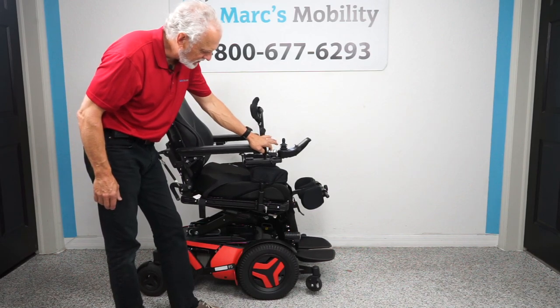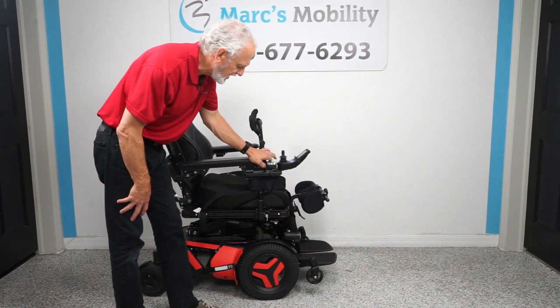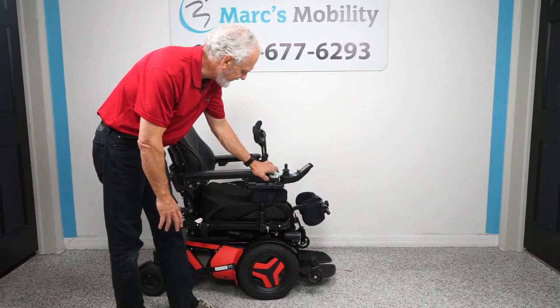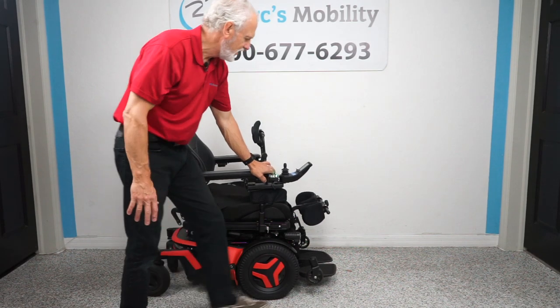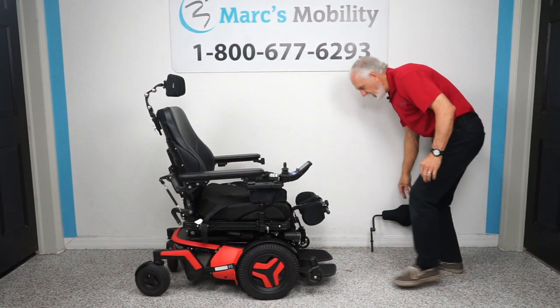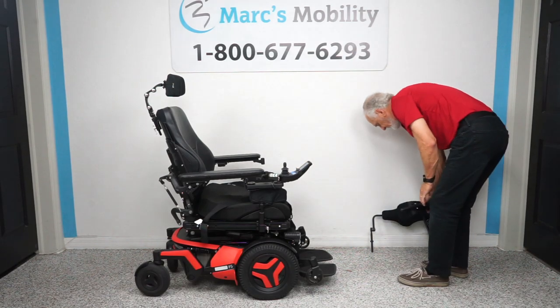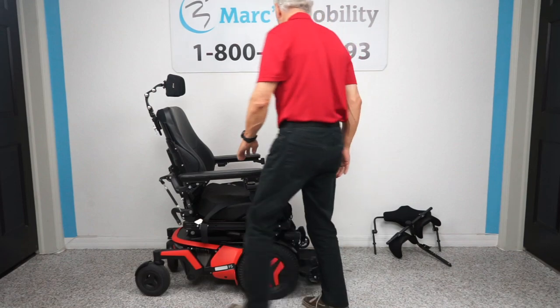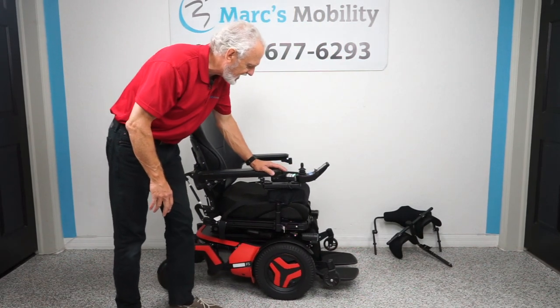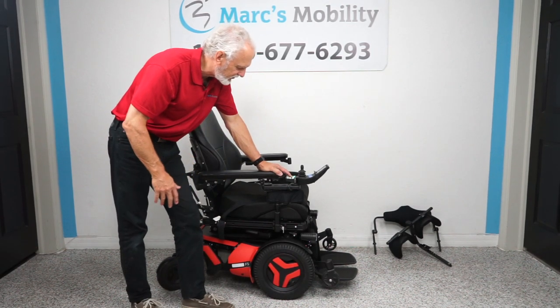If you need a chair to help you stand up, this is the only one I know of — it's a Permobil, the highest quality you can get. Now with the seat all the way back down we no longer need the chest guard or knee brace. The next thing I'm going to show is the seat lift. This is one of the few chairs with a 14-inch seat lift — most power chairs have 10 or 12 inches.